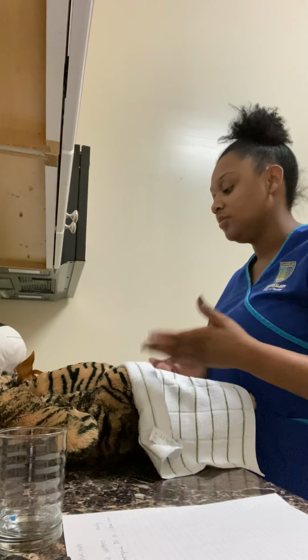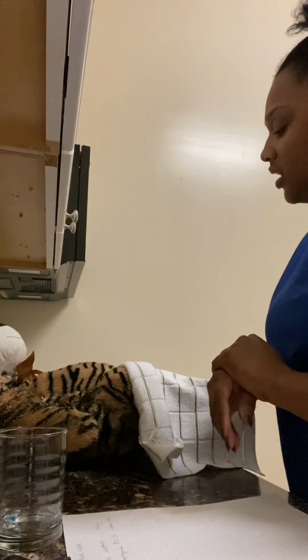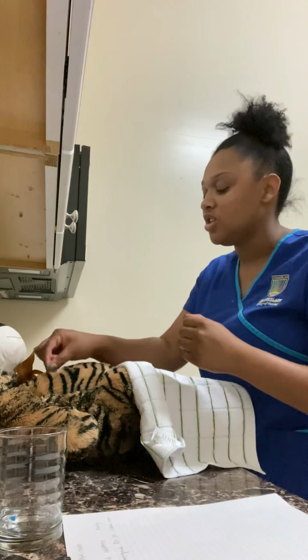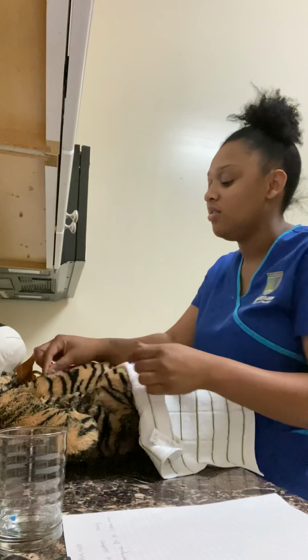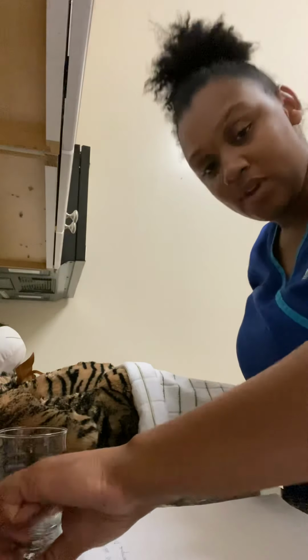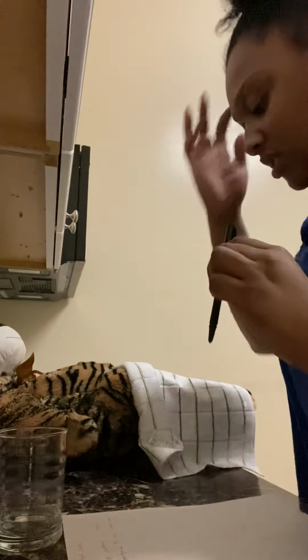We will then perform hand hygiene and don my clean gloves. Okay, Mr. Teddy, I have my alcohol wipe I'm going to use to wipe the injection site, which is about 1 inch above the umbilicus. Now that we have wiped that area, we will disregard that into the trash bin. We will let that dry. I will then pick up my injection, my needle, which is my insulin, my 5 units.